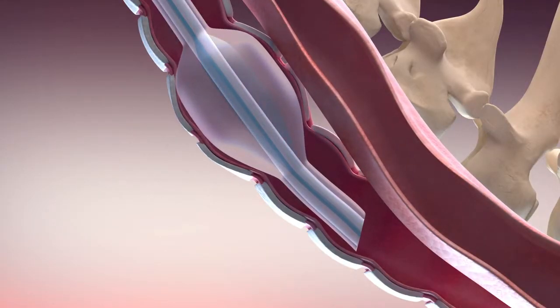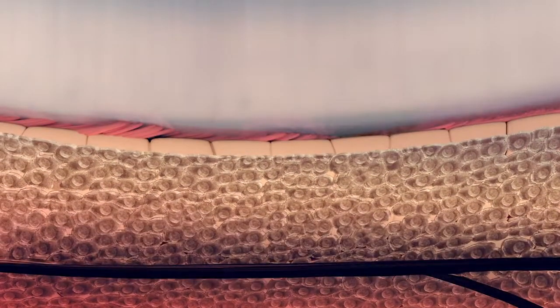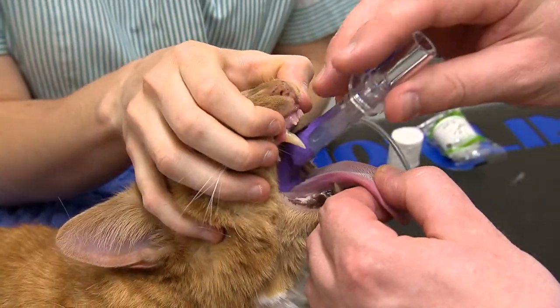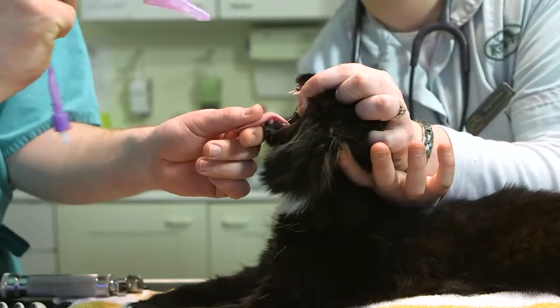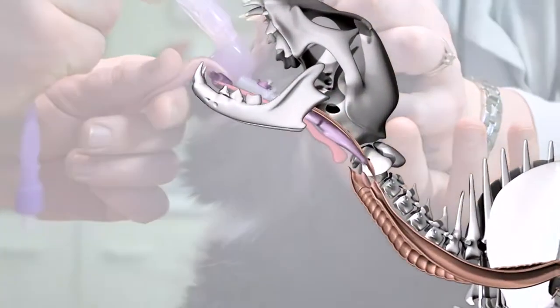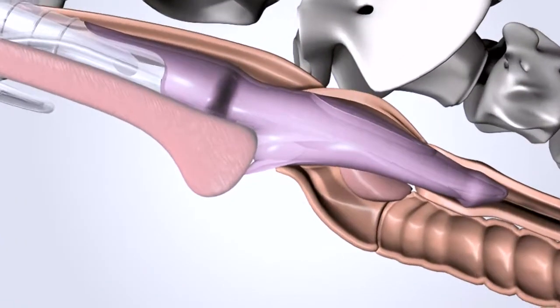Overinflation of the tube cuff and the inevitable movement of the tube during dental work will also cause damage. Using V-gels is the answer to this problem. Because the V-gel does not touch the trachea, it eliminates the risk of tracheal trauma and makes for exceptionally comfortable recoveries.